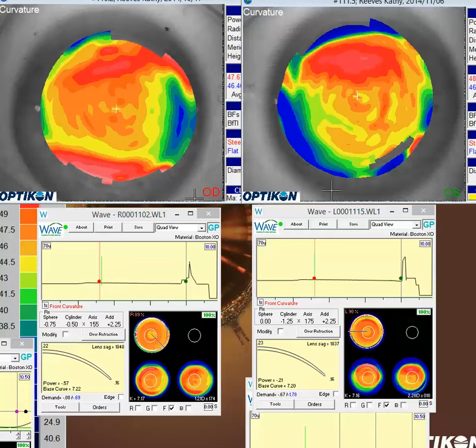If we look at your left eye, probably a similar issue. And as you know, you get the steep ridge up here in the superior cornea. And if you picture putting that lens on there, that lens is probably going to slide right down this here. If you picture like the side of the mountain, it's going to slide right down the slope and want to decenter inferiorly. So that'll account for some of your fitting issues.